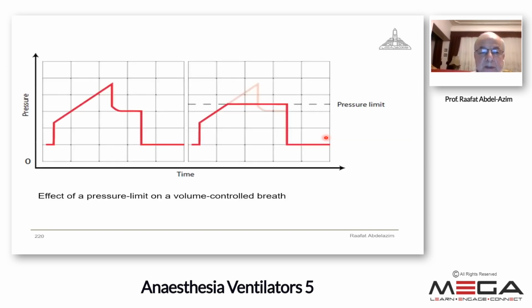The one on the left side is the volume control, the pressure changes, the peaked graph, and the one on the right side is the pressure limitation.